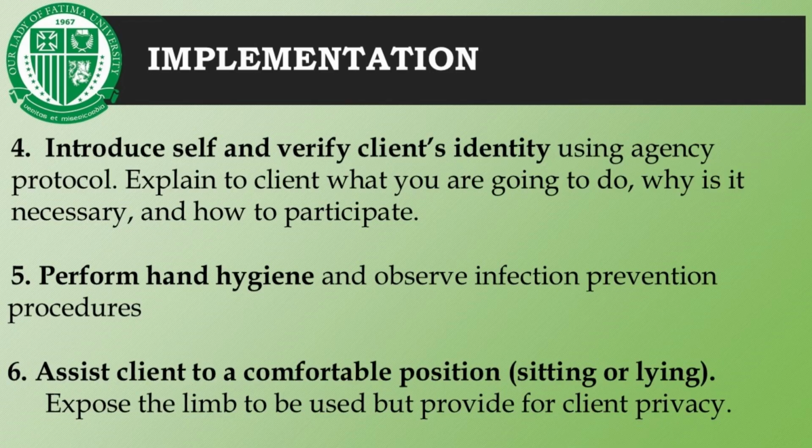It reduces the risk of introducing pathogens to the patient during the procedure, which ensures a safe and sterile environment for IV insertion. Assisting the client to a comfortable position, sitting or lying, minimizes discomfort, and allows easier access to the chosen site for IV insertion. Expose the limb to ensure proper visibility of the veins while maintaining privacy, which respects the patient's dignity and comfort.